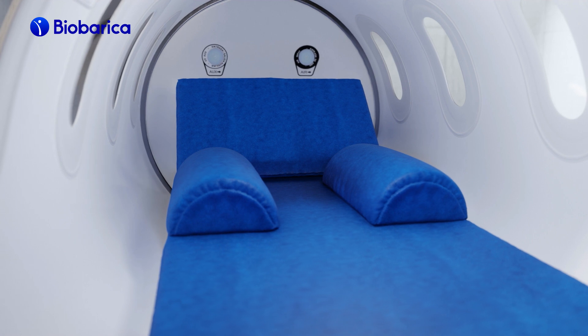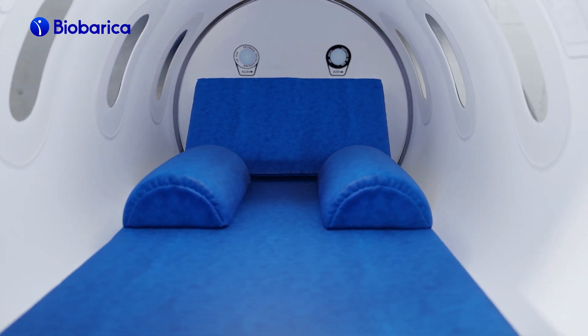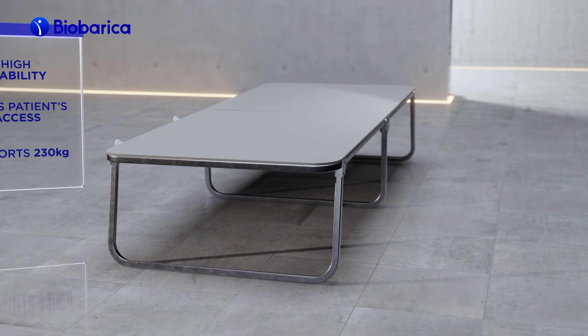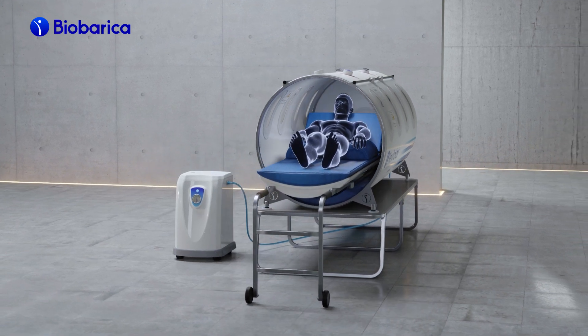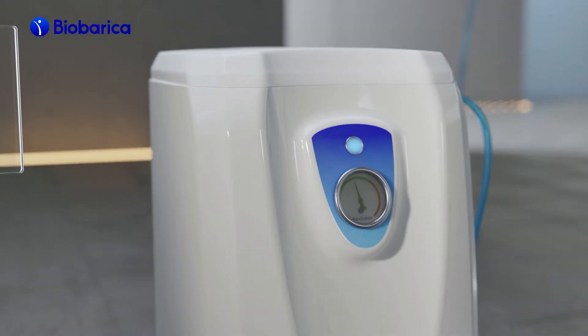Its interior is spacious and comfortable. It has internal supports, a hypoallergenic mattress, and pillows that guarantee comfort for the patient during each session. The chamber also includes a support table to make the patient more stable. In addition, it is possible to include a removable stretcher that facilitates the entry of patients with reduced mobility.